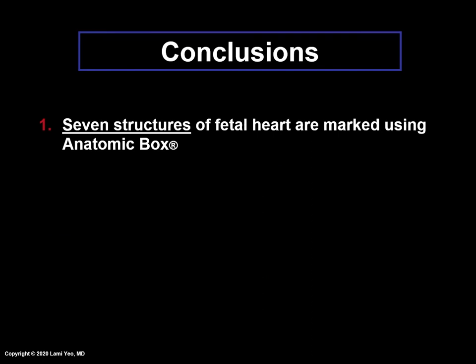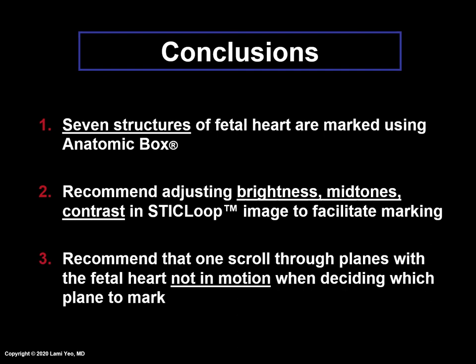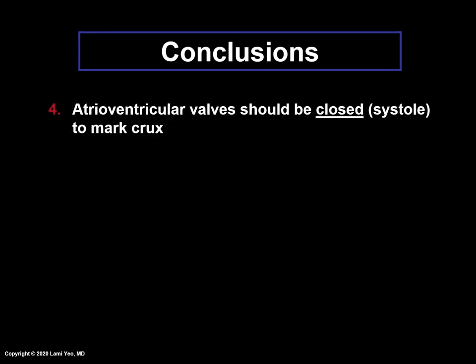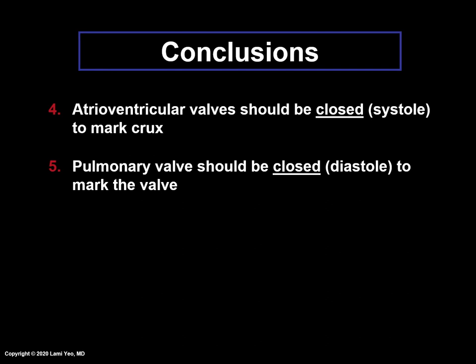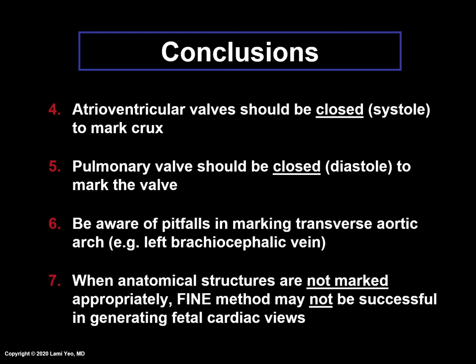In conclusion, seven structures of the fetal heart are marked using Anatomic Box. We recommend adjusting brightness, midtones, and contrast in the STICLoop image to facilitate marking. We also recommend scrolling through the planes with the fetal heart not in motion when deciding which plane to mark. The atrioventricular valve should be closed in systole to mark the crux. The pulmonary valve should be closed in diastole to mark the valve. Be aware of pitfalls when marking the transverse aortic arch, such as the left brachiocephalic vein. When anatomical structures are not marked appropriately, the FINE method may not be successful in generating fetal cardiac views.